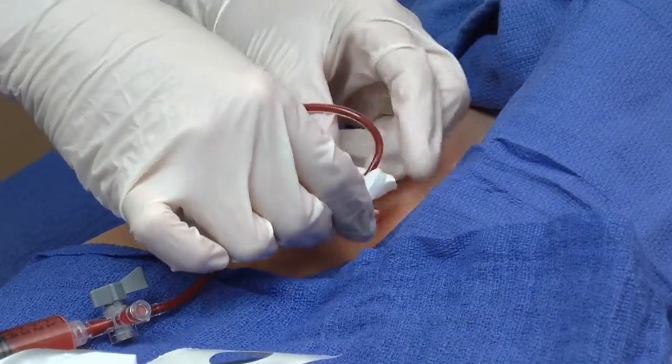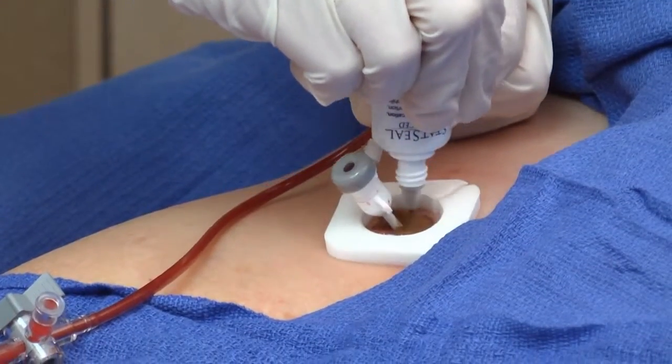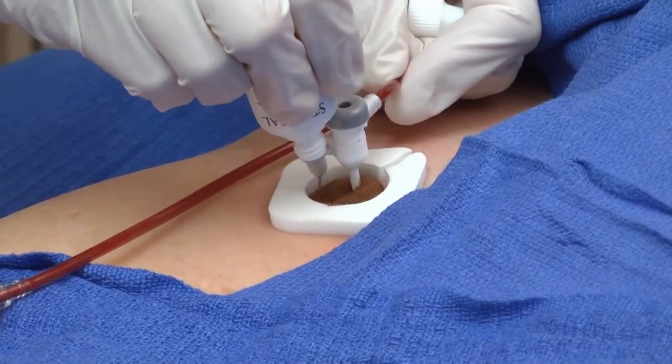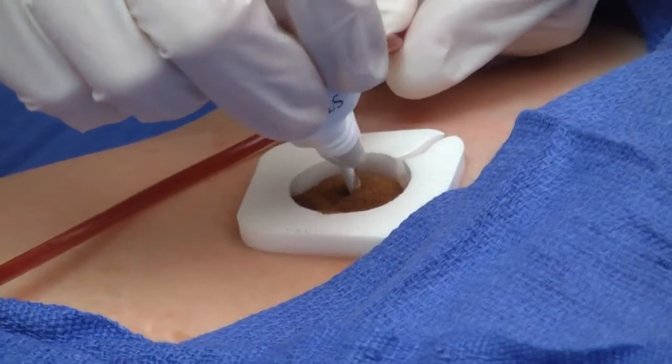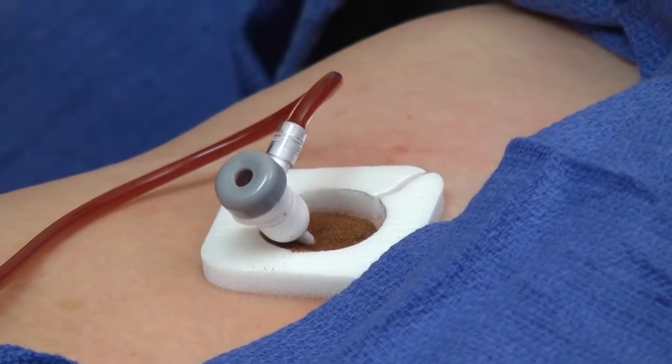Peel off the paper backing and center the PCD around the sheath. Pour the powder into the PCD. Lift the sheath gently to ensure that the powder gets under the sheath.